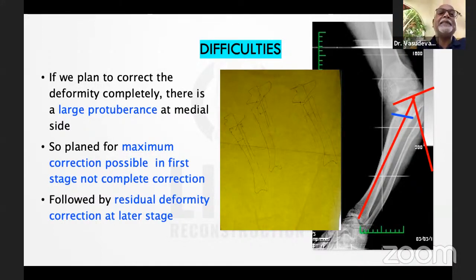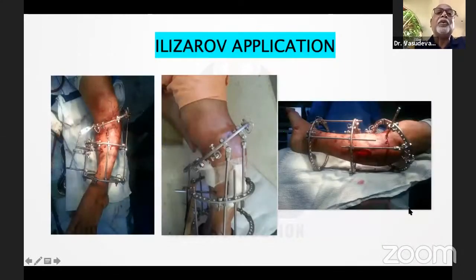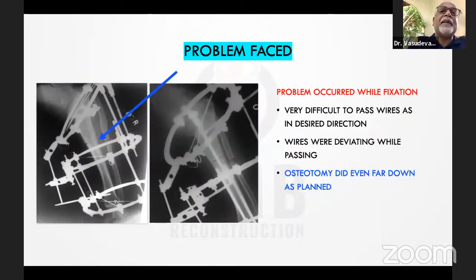So I take a 3D CT scan, and I personally go to the scan center and sit and plan it on their CT computer. And nowadays I have started doing even rotation into the hinges. Because you know the oblique plane is AP and lateral, you combine it to an oblique plane.